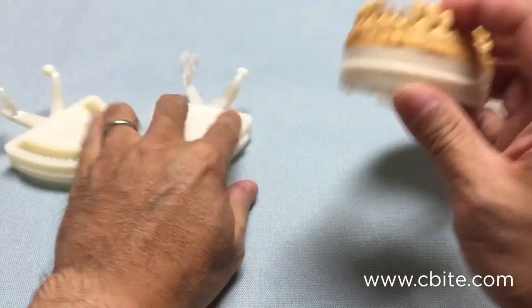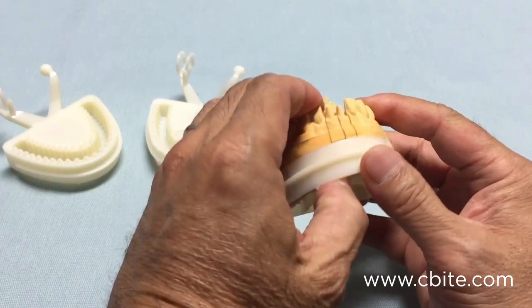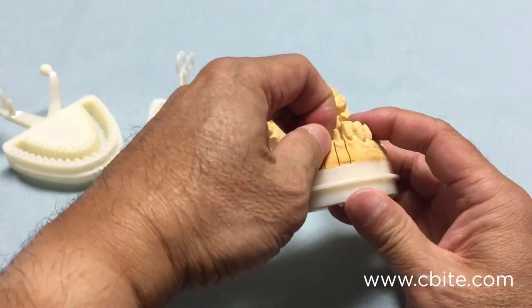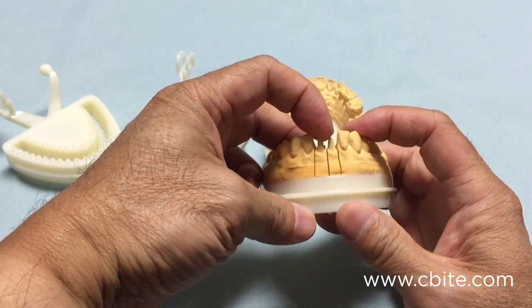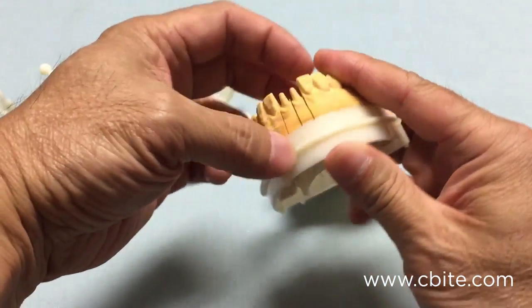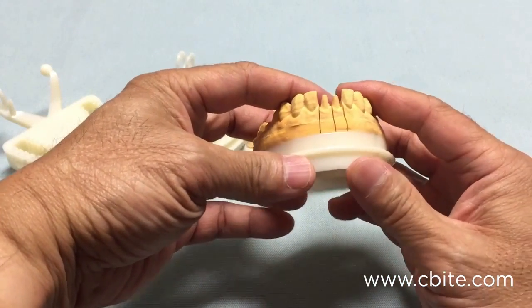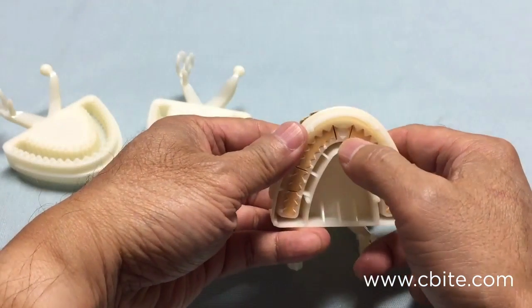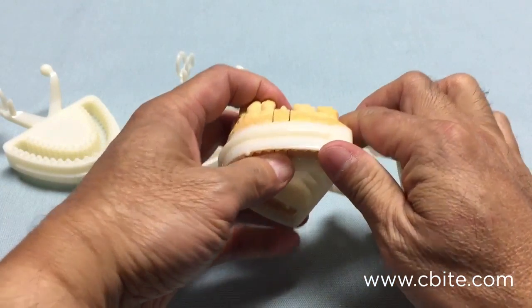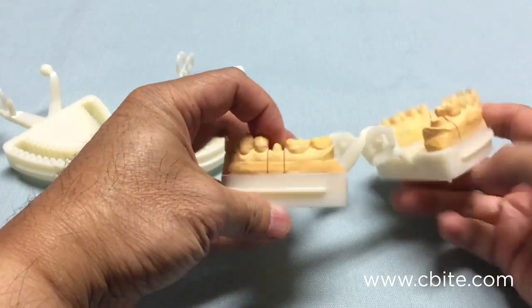Even with very thin dies — as you can see, the lower anteriors here — they come out easily, but once seated in place they just do not move; they are very sturdy. You do not use pins here, so you don't have to worry about thin dies with pins breaking on them. Extremely stable.